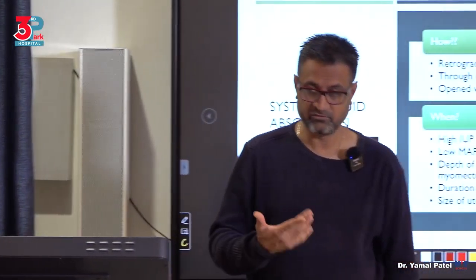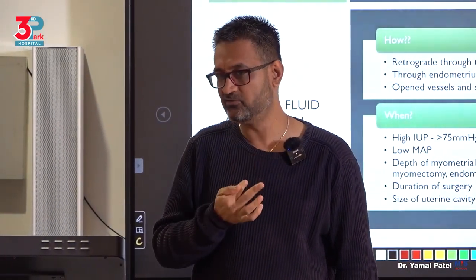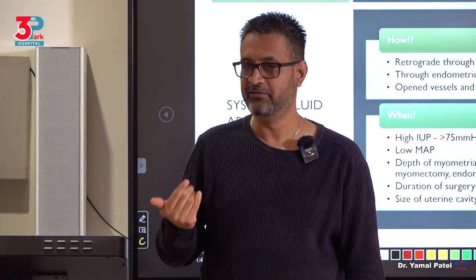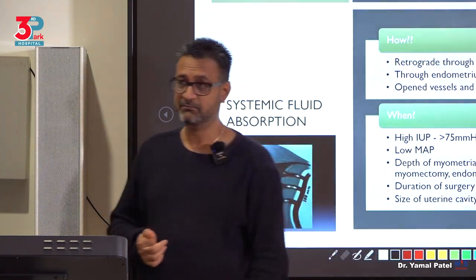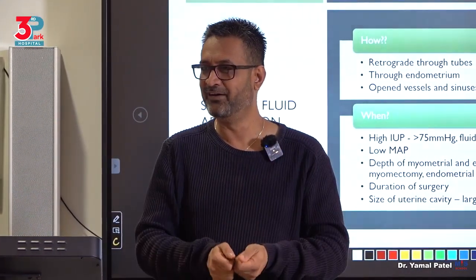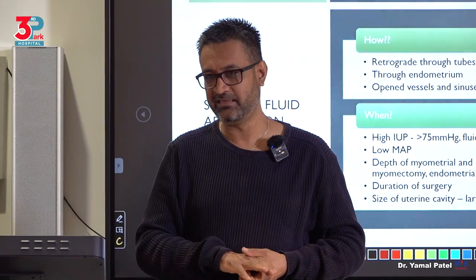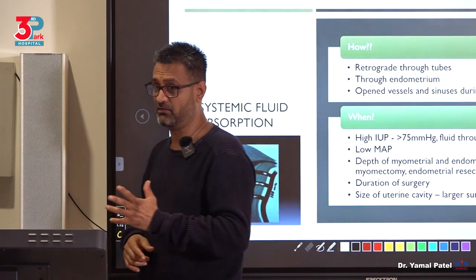I told you in the normal hysteroscopy, diagnostic hysteroscopy, I do it for all my patients. I don't take more than 1 to 2 minutes, all right? And even in operative procedures, I don't take more than 15, 20 minutes. But these are my figures now after so many years. I know people can be in there for 45 minutes to an hour to 1.5 hours doing hysteroscopy. Trust me, if you're doing that, you are overloading that patient by the duration you're taking, okay? It's not right.